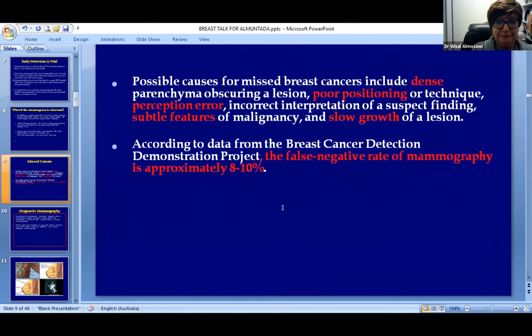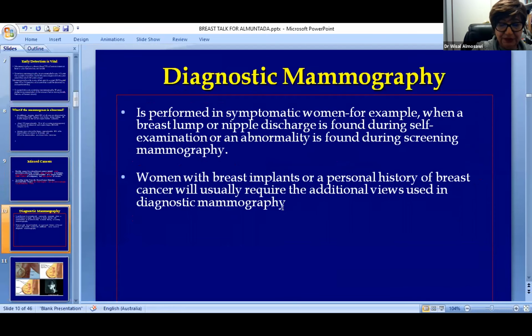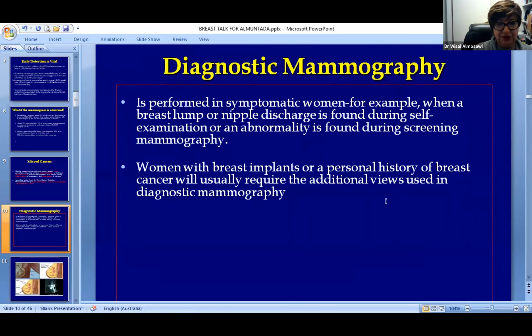these factors I mentioned. So we talked about screening mammography versus diagnostic mammography. Screening, when you send them to screening center, they don't see anybody, just the technician. And then if you need workup, then they send them back for diagnostic mammography, where we do X-ray images, we do compression magnified views, we do ultrasound, we examine the patient, and we might even need to refer them to a surgeon. So that's the difference. Another important point is a woman with breast implants or personal history of breast cancer will usually require additional views anyway, so they have to go to diagnostic imaging.